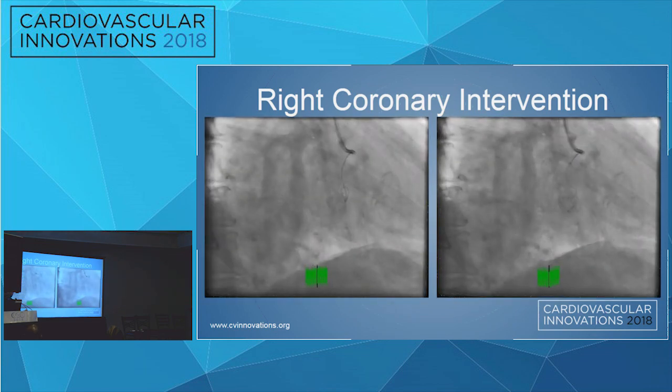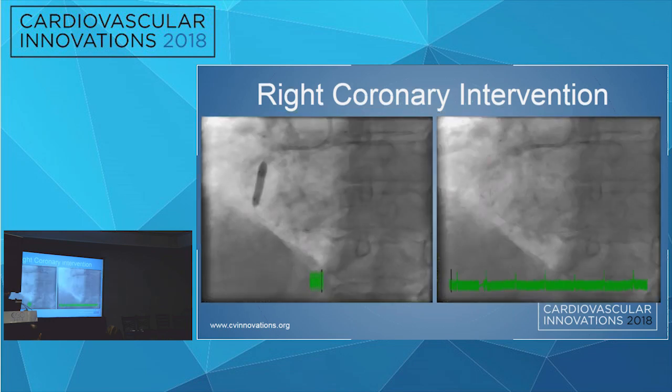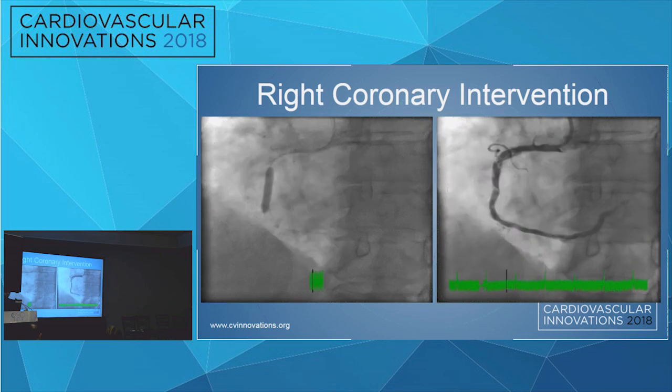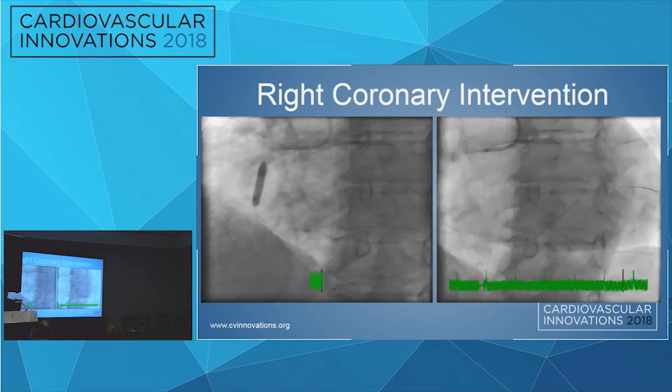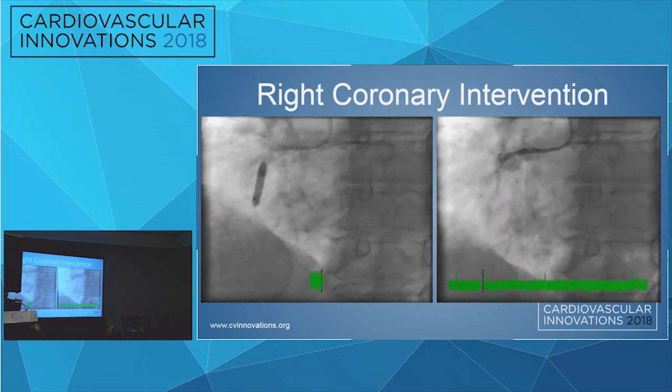So on the left-hand side is the panel with the PT Floppy, not really going anywhere. I actually let the interventional fellow have a go at it first, and of course this is a challenging vessel to wire. On the right-hand side is a PT2 Moderate Support, which ultimately went. I initially started by ballooning that mid-right stenosis just to clarify my inflow and outflow and get a better look at the vessel.